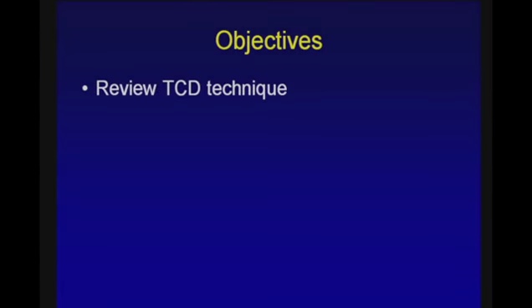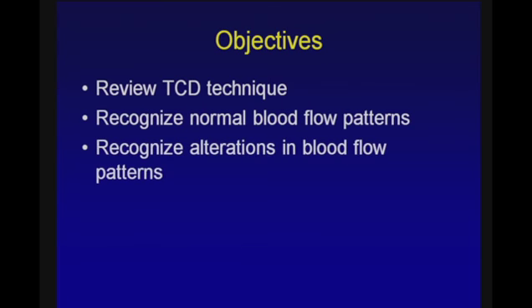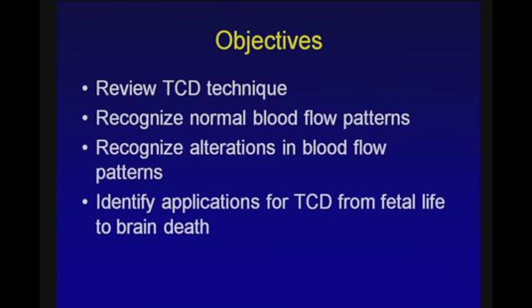So the objectives of this talk include reviewing the technique of transcranial Doppler, recognizing what normal blood flow patterns are, recognizing alterations in these blood flow patterns, and identifying applications for transcranial Doppler extending from as early as fetal life to brain death.